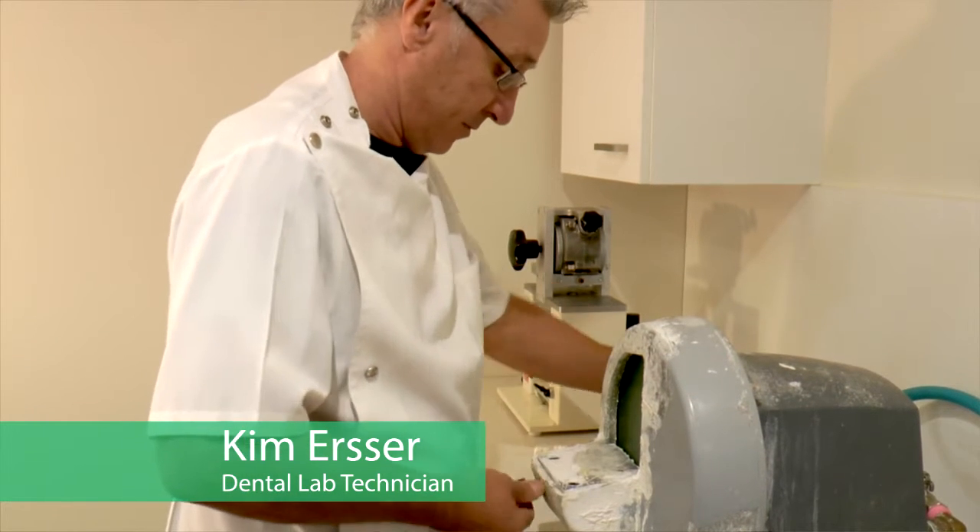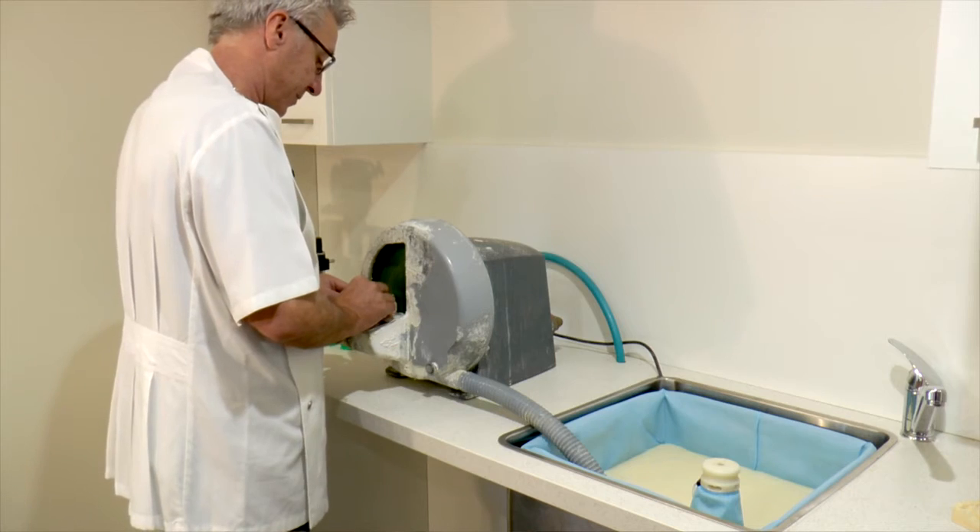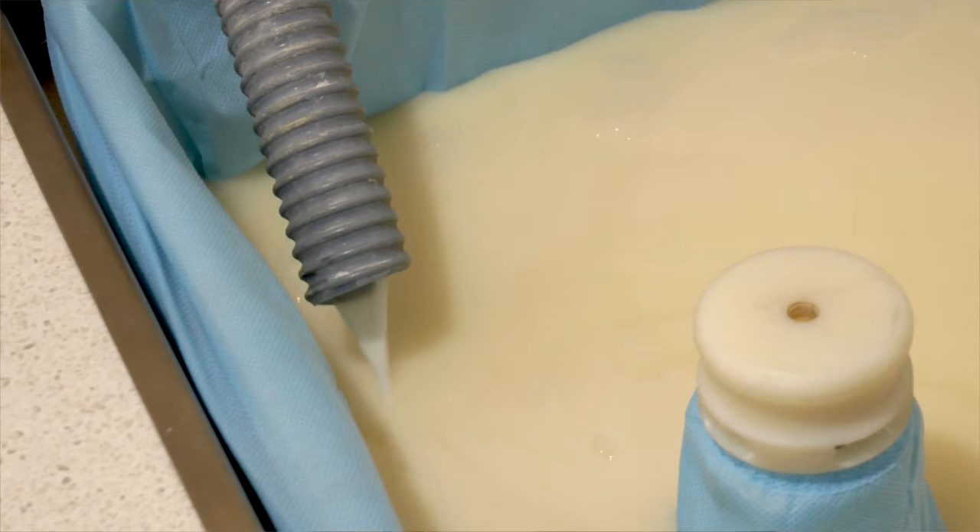Hi, my name's Kim. I'm a dental technician. Traditionally, with sinks and waste water, we've always used under-the-sink plaster traps, which were fraught with problems with smell, blockage of pipes, and hard to clean.